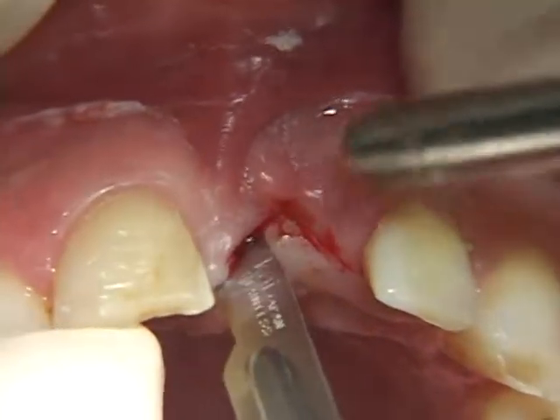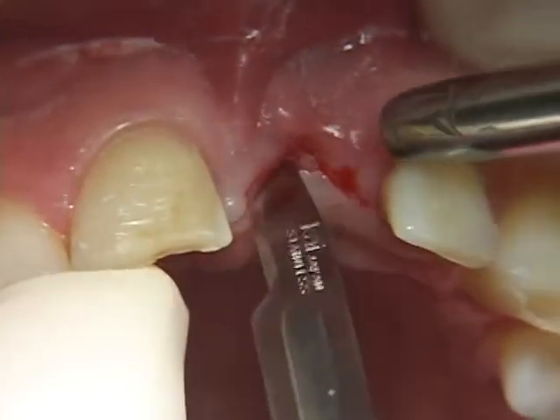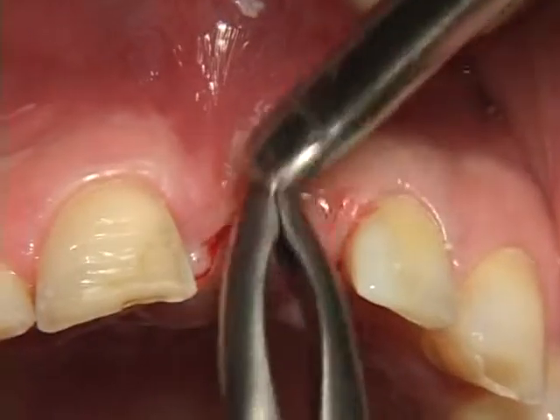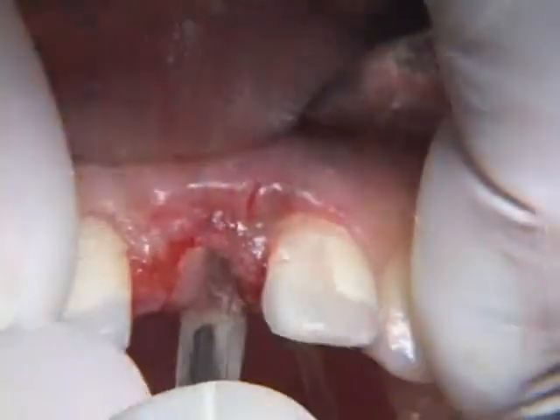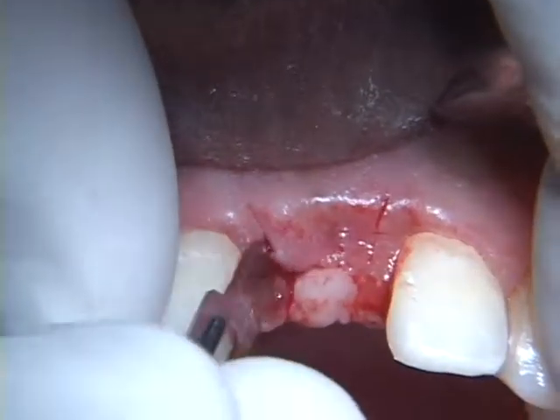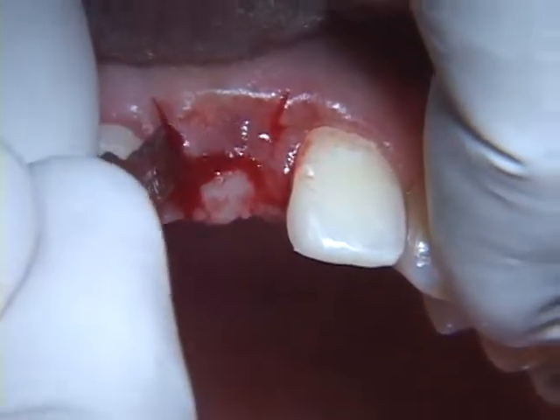For aesthetic areas, such as the maxillary incisors, the incision should be semilunar. Relieving incisions for the semilunar flap can be made near and along, but not through, the gingival margins of the adjacent teeth.